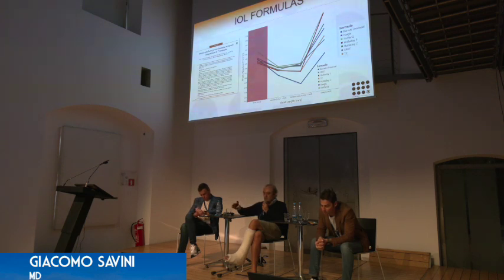What is the prediction error? The difference between the post-operative refraction and not the target, but the predicted refraction. Of course, if I operate two patients, and one ends up -5 and the other one ends up +5, and I take the arithmetic error, it is 0, I feel very happy. The patients are not very happy. So that's why we always consider the absolute prediction error, which would be 5.